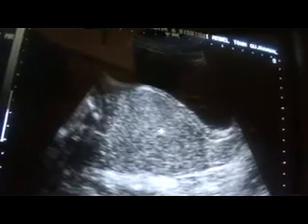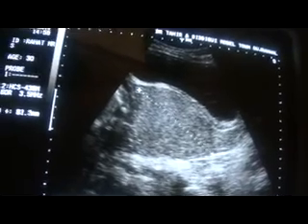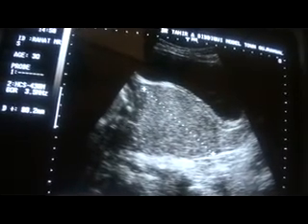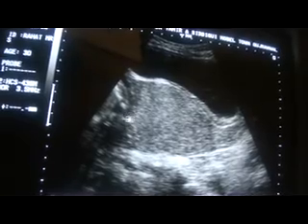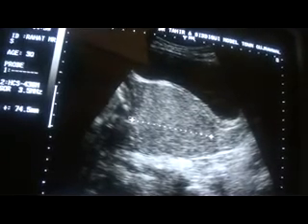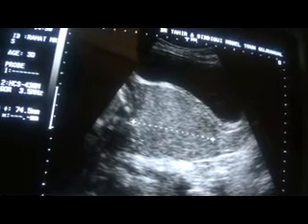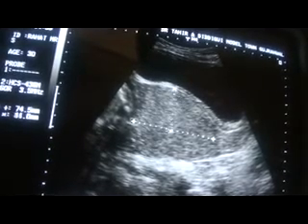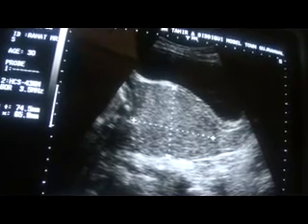So the area of study is this evenly echogenic area with no significant posterior acoustic enhancement, with no internal calcifications or solid element. It is well demarcated and is in the region of the cervix.